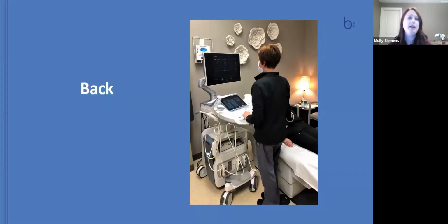So if you are accustomed to sitting while scanning and you start noticing hip or back pain, try standing to scan. Standing can take the pressure off those intervertebral discs while allowing for more mobility in the muscles of our pelvis and hips. Standing is especially helpful for exams that could potentially require a lot of twisting of the body, such as lower extremity venous exams, when one has to turn to augment the leg. When standing, we want to make sure, however, that we are standing with both feet in front of us and that the patient is still as close to us as possible.